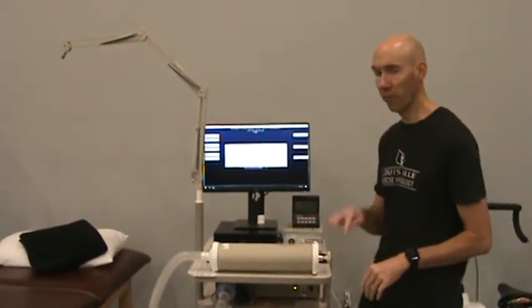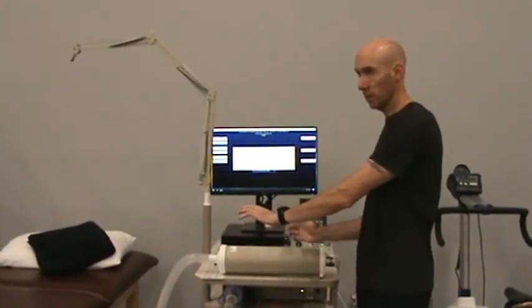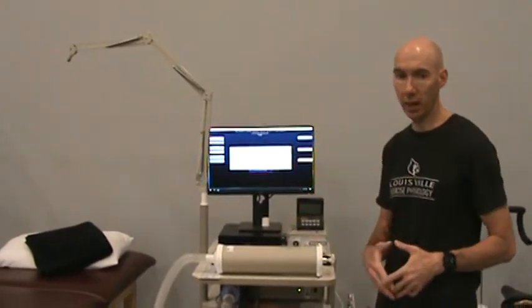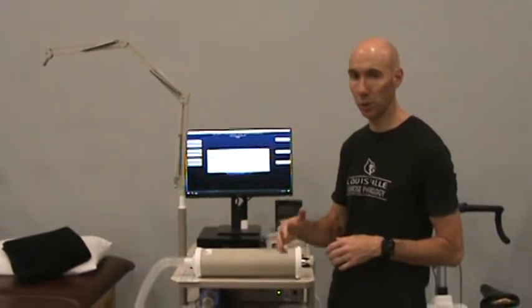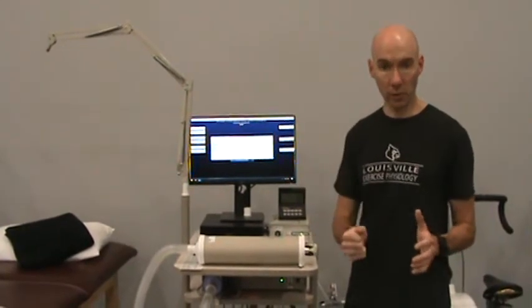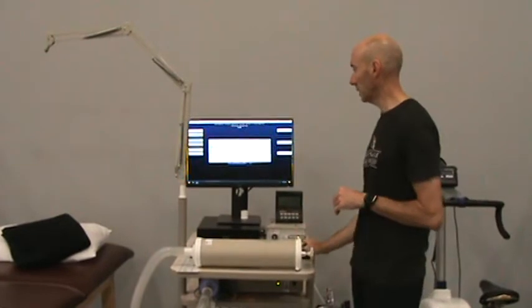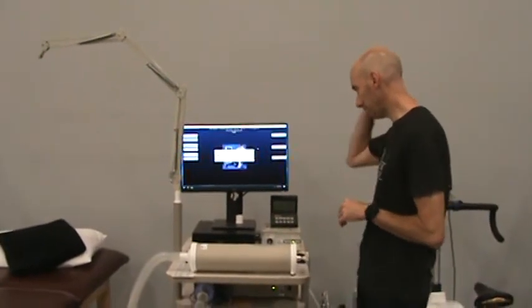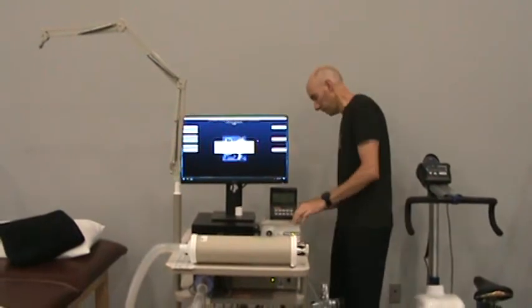So I'm going to perform 5 very slow pumps that will simulate the breathing that our subject will be doing during the test. Now we'll contrast this with an exercise test, which we'll show you later in the semester. We'll be pumping it much faster, moving higher volumes of air, because that's what occurs during exercise. Okay, so this is for resting again, so I'm going to click sample baseline. Make sure our dilution pump is turned off, which is here.